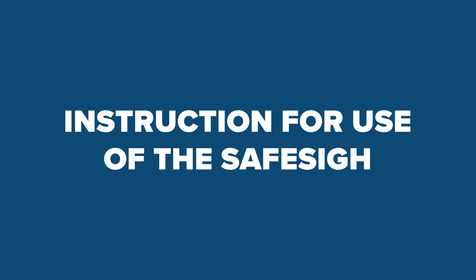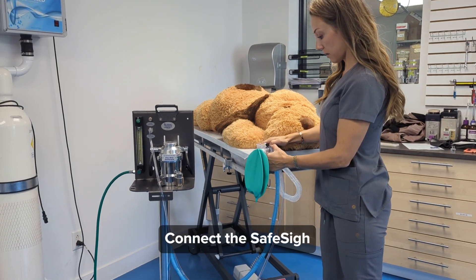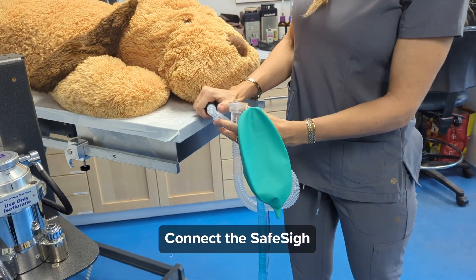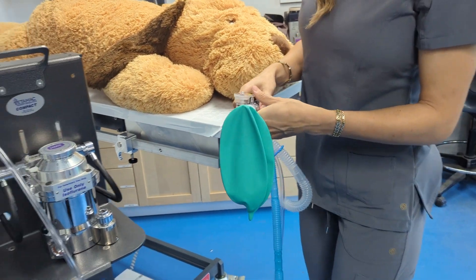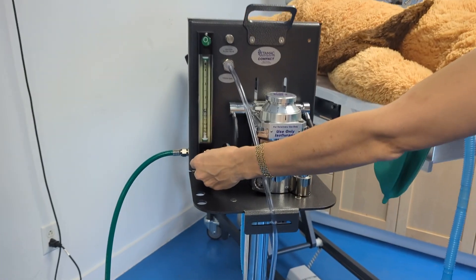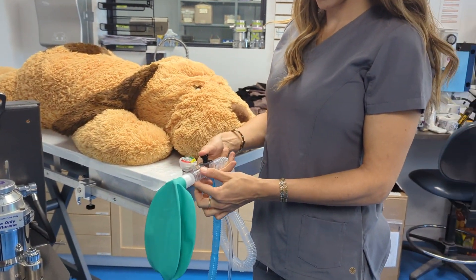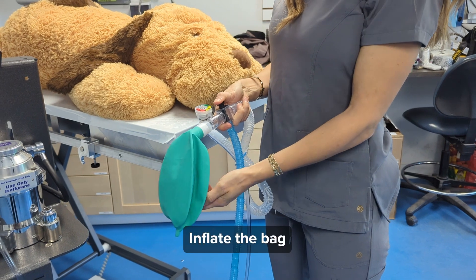Instruction for use of the SafeSigh. Connect the SafeSigh. Inflate the bag.